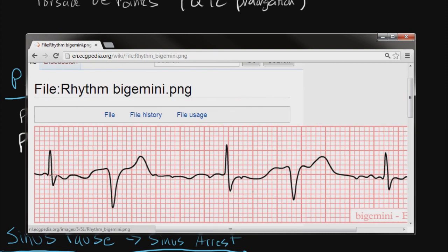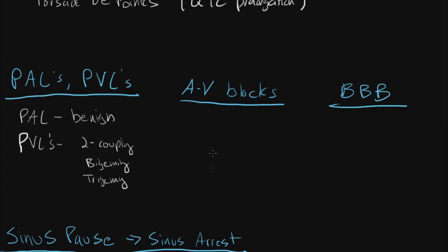This is bigeminy — you have a normal sinus rhythm and immediately after you have a premature ventricular contraction, then again a sinus rhythm and a premature ventricular contraction. If you had two sinus rhythms and then a ventricular contraction, that would be trigeminy because it happens every third beat. If you have two PVCs in a row, that's couplet — distinguished from having three PVCs in a row, which are no longer PVCs but ventricular tachycardia.